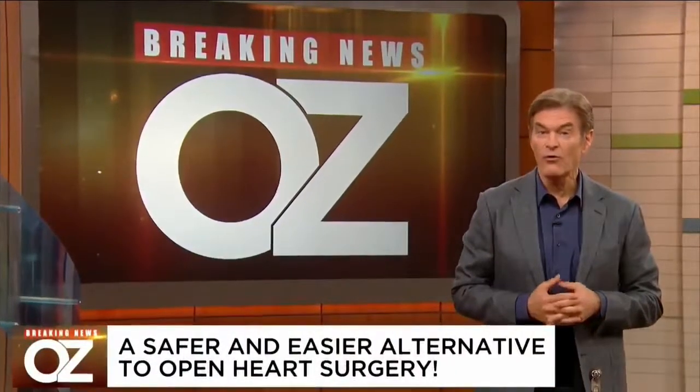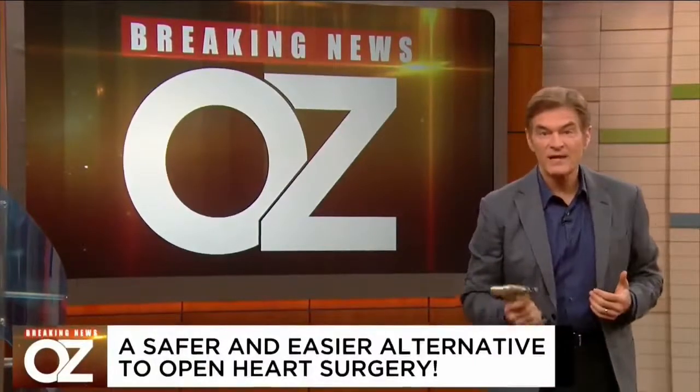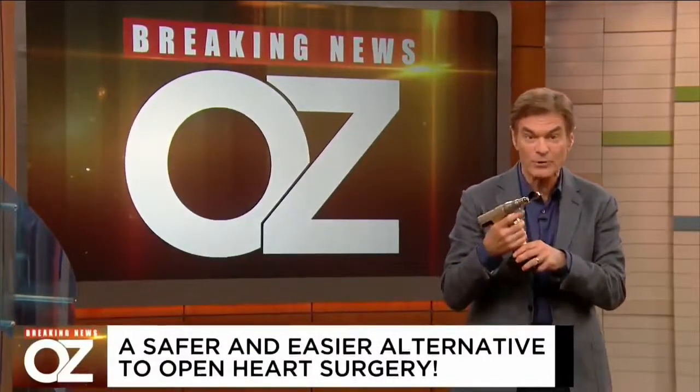News, in fact, breaking news about your heart. Is open heart surgery becoming a thing of the past? Well, we all know someone who's had that kind of invasive surgery with the big cut in their front. It's made with a device like this that we use as heart surgeons to saw open the ribs and expose the heart. I grew up doing this.